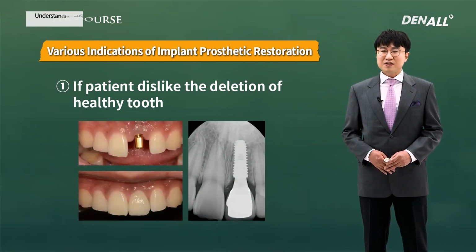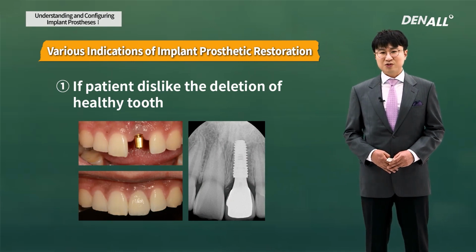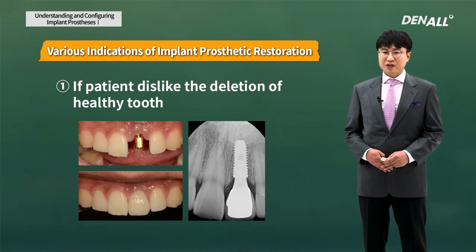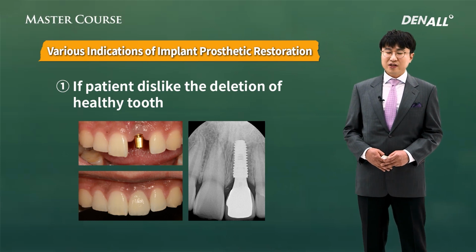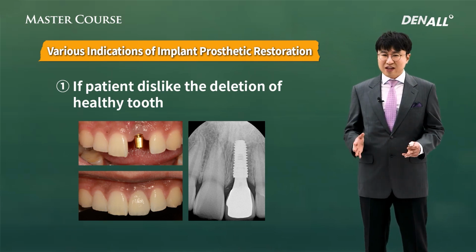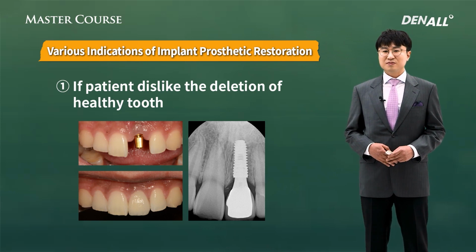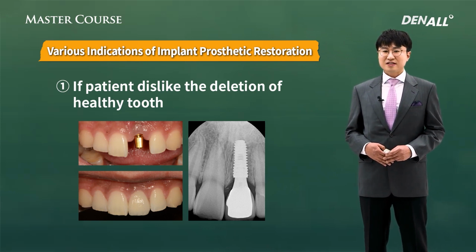After the initial conditions and thorough assessment after implant delivery, if the condition is right, then you can use a provisional, or if the provisional can be quickly connected using the active surface, or the BA surface fixture of Osstem, then you could actually reduce the treatment time. In the anterior side, how to do early loading or immediate loading will be covered more in the master course.